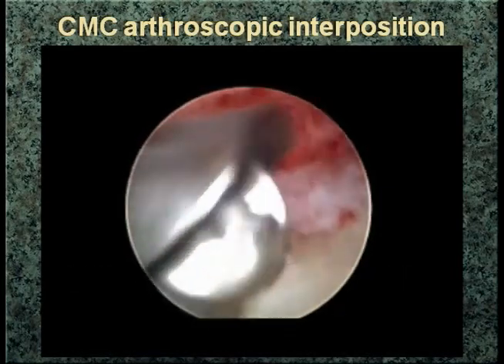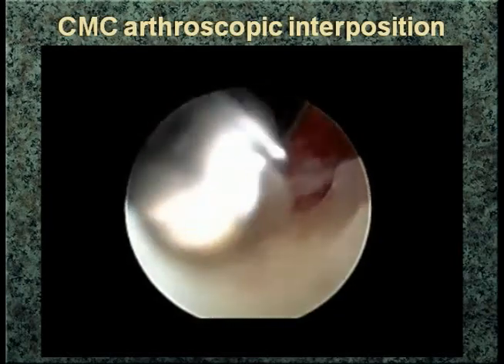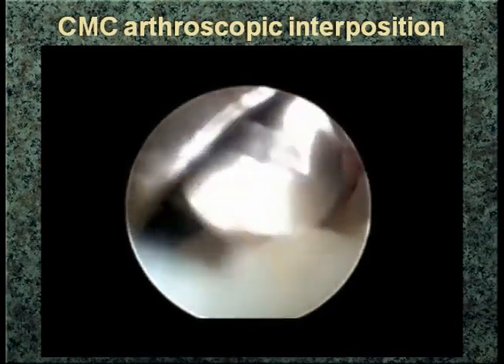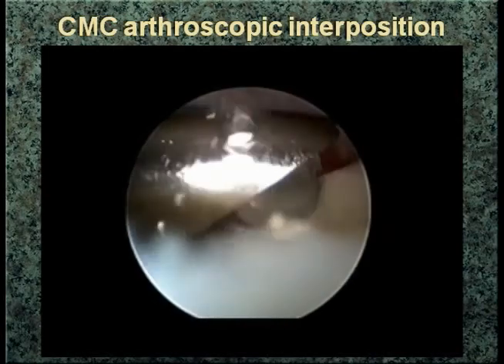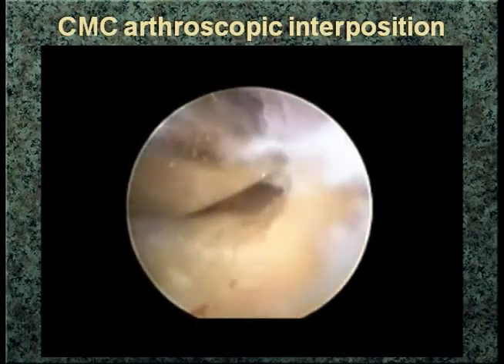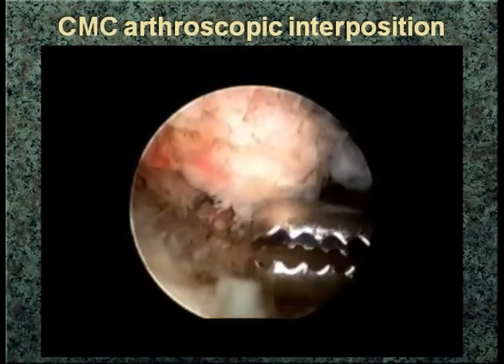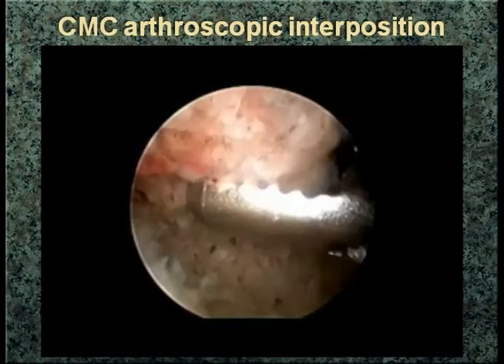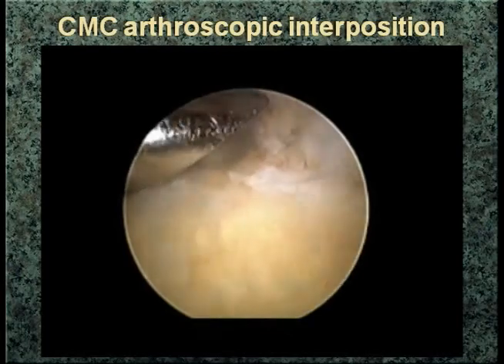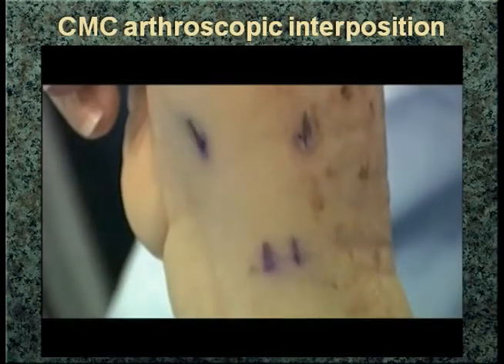When you first get in there, you're just trying to create a space, and I use a synovial shaver for that. Once I've obtained a view and used the RF probe — not so much for shrinkage but to delineate the entire trapezium — you can see the burr in there. Until you've resected about two to three millimeters, it can be quite difficult to actually see in there. One thing I would caution about is the center of the trapezium — it's a soft area — and you want to make sure you get the osteophytes, as David said, and pull out the loose bodies. It's tempting just to create a bowl, but you need to get the cortical edges both medially and laterally.